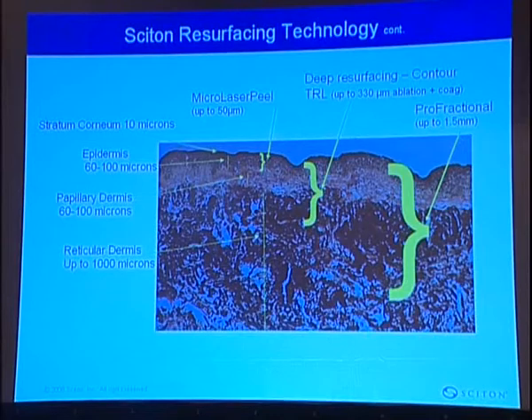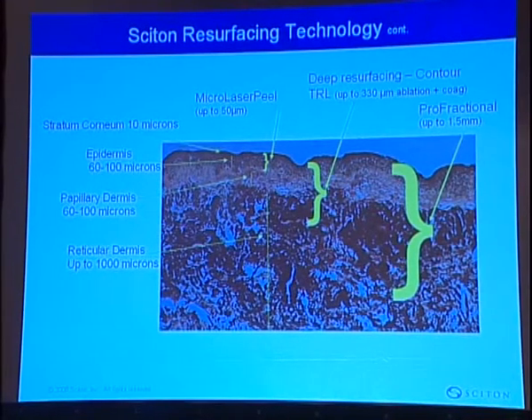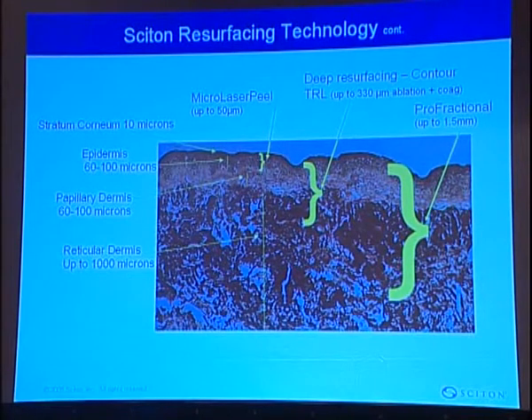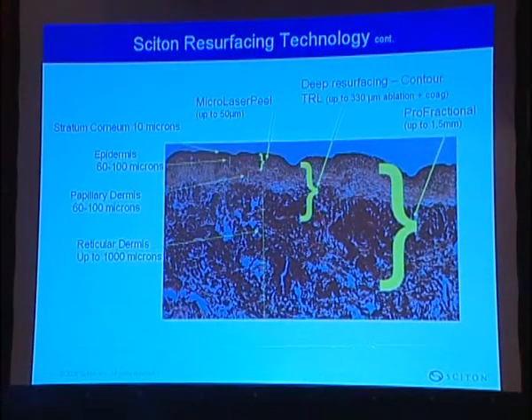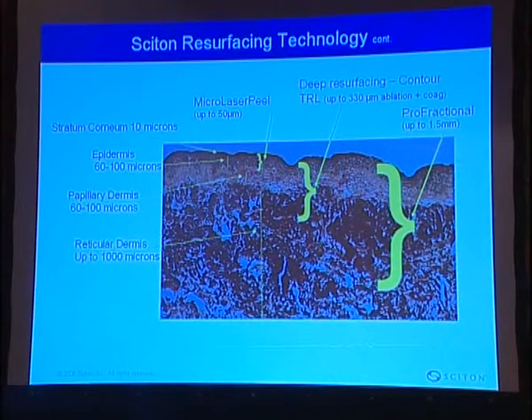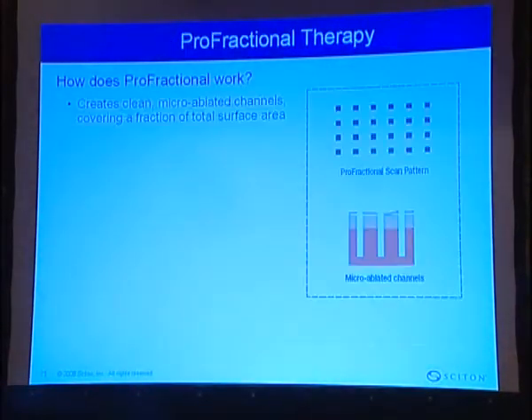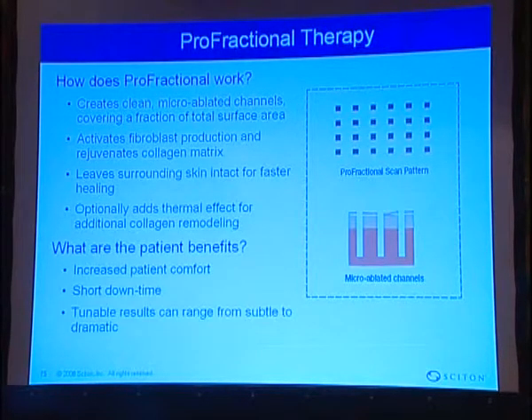And this is something which we might use only in cases of hypertrophic scars or keloids, where instead of doing the CO2 drilling, we can use this device in a fractional mode with ablation only, with a large depth of ablation, in combination with intralesional steroid injection, and in this case we get very good regression of hypertrophic scars. So this is how it actually works.